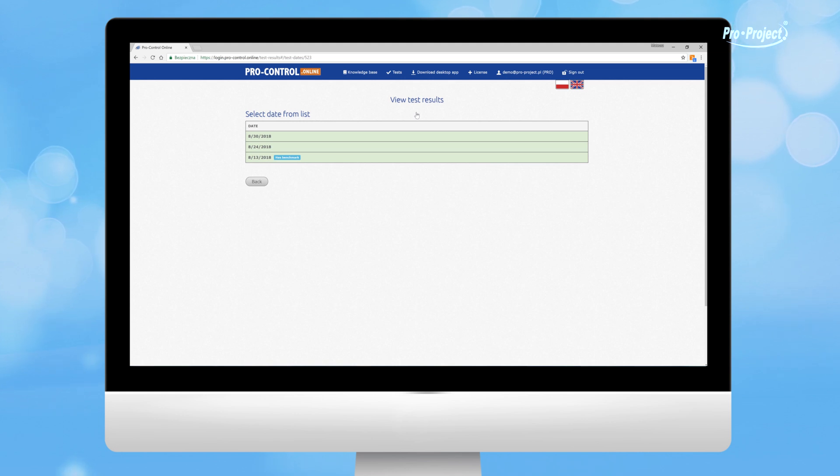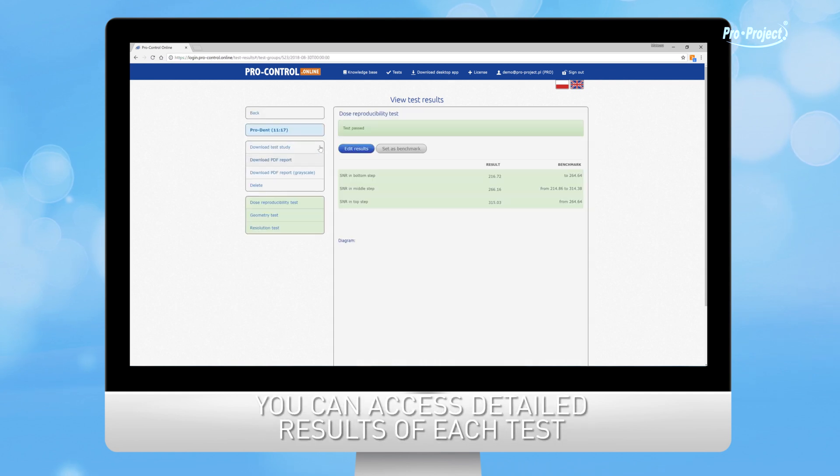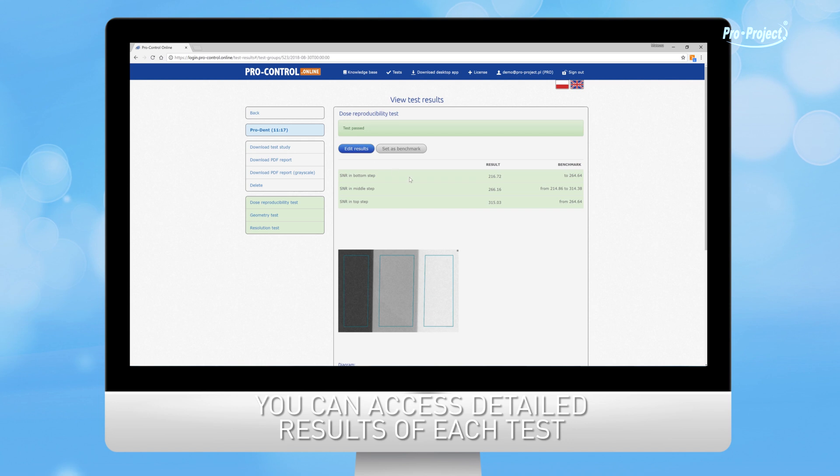If it is red, one or more tests have failed. After clicking on the date, you can access detailed results of each test for a given date.